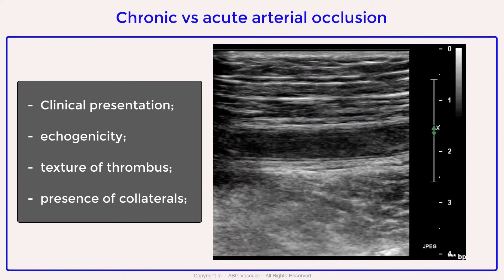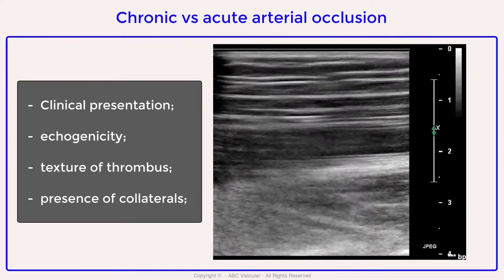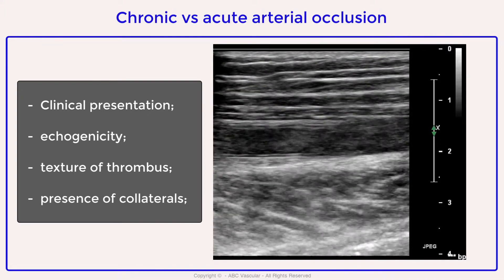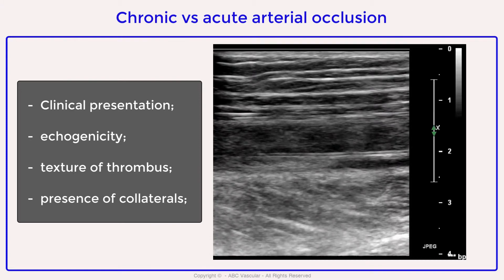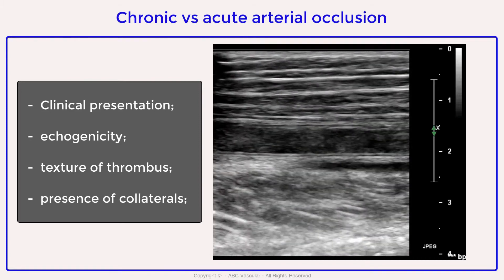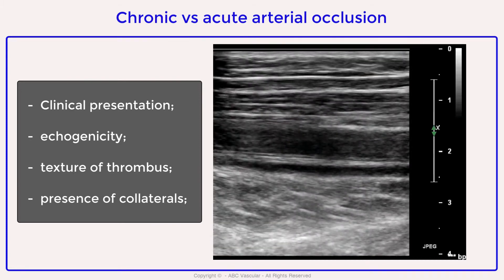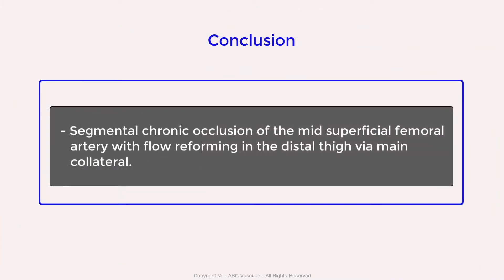The presence of arterial collateral vessels, alongside the clinical presentation and the echogenicity and texture of the thrombus — which appears well attached to the wall, non-mobile, and hyperechoic — are indicative of a chronic occlusion rather than an acute occlusion.